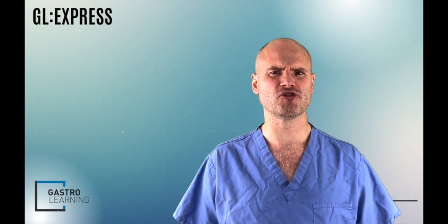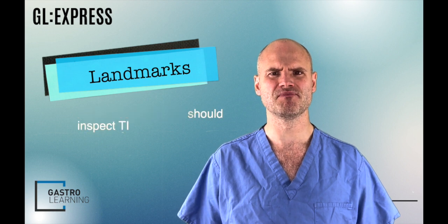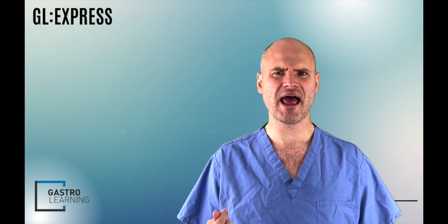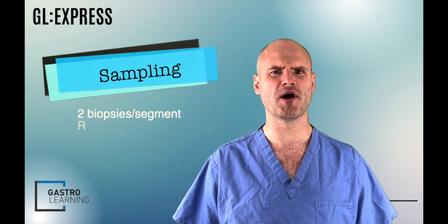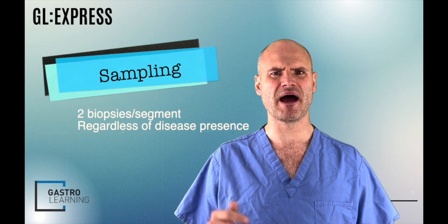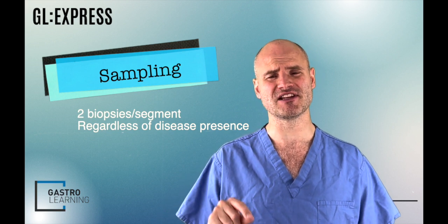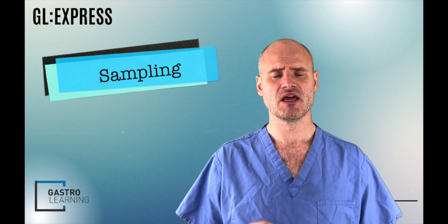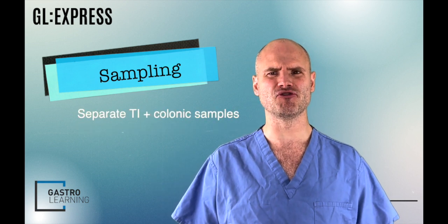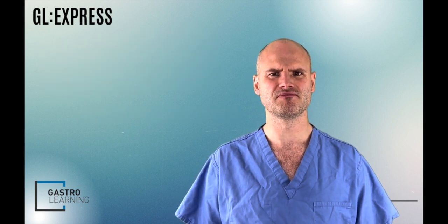The working group also suggests that all colonoscopies in patients who are suspected to have inflammatory bowel disease should reach the terminal ileum. And where IBD is suspected in colonoscopy, patients should have 2 biopsies from each area of the bowel, whether that area is macroscopically normal or is affected. So those are the areas we just mentioned earlier about photo documentation. They also recommend that biopsies from the terminal ileum are placed in a separate pot than those from the colon.